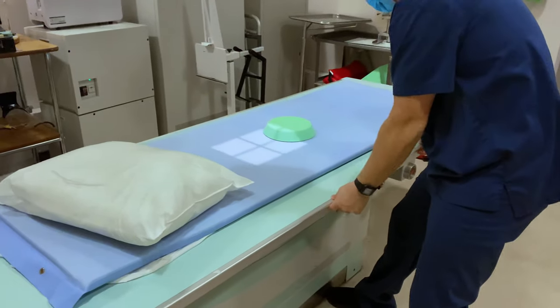Now I'm going to have my intern Jerry demonstrate a very common mistake that I made — and I'm sure you will encounter as well. The mistake was that I would always run out of track for my bucky when positioning my patient. I'd then have to pull the mat or sheet to reposition the patient up on the table, then move my central ray and bucky up, realign, and reposition — such a hassle. So here we go, the patient just got on the table.